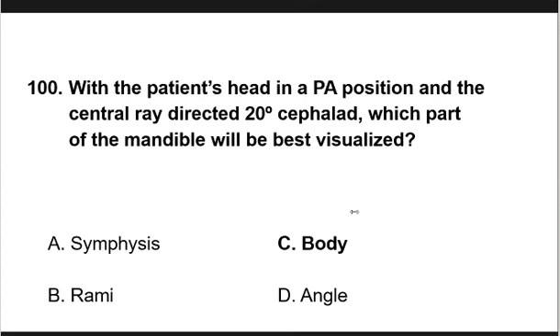Ang tangential naman, kailan natin ginagamit ang tangential? Kung ang body part ang ina-angle natin. Walang kinalaman ang tubo. Body part. So kung ang body part ang ina-angle natin, tangential ang tawag doon. Pero kung axial, tubo ang pinag-uusapan, not part. Tubo na mayroong 10 degrees above. Kung ang angulation mo ay 8 degrees, 9 degrees, hindi pa axial yun. Okay?